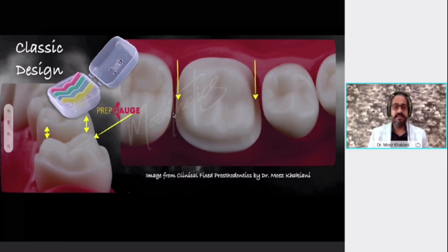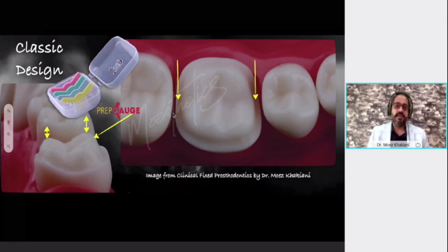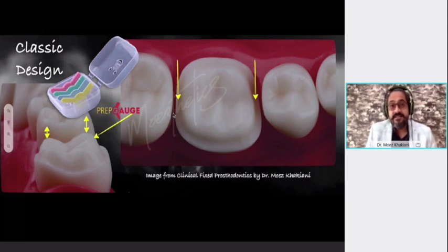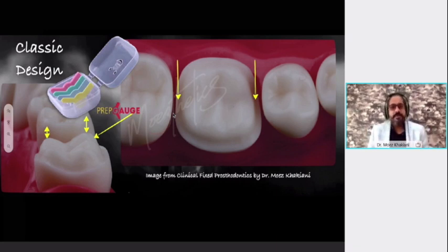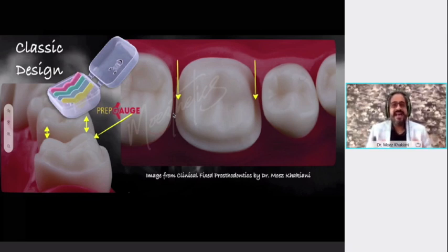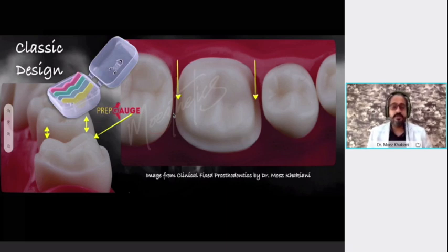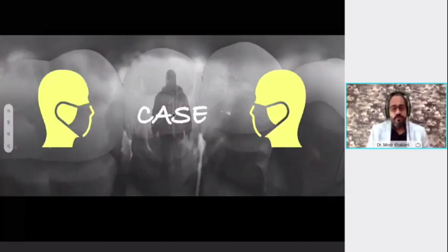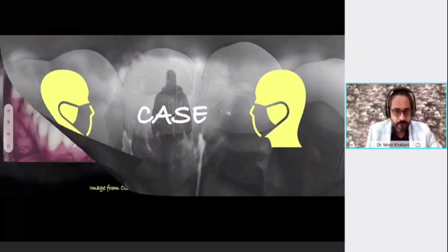To gauge reduction, use prep gauges. The yellow prep gauge is 1 mm — use it for the non-functional cusp. The blue is 1.5 mm — use it for the functional cusp. The Mik Dental team tells me that after the first webinar, a large portion of the audience purchased the prep gauges. I'm happy to hear that, because it seems what I'm sharing is having a positive impact and bringing about a positive change in your practice and approach toward occlusal preparations.